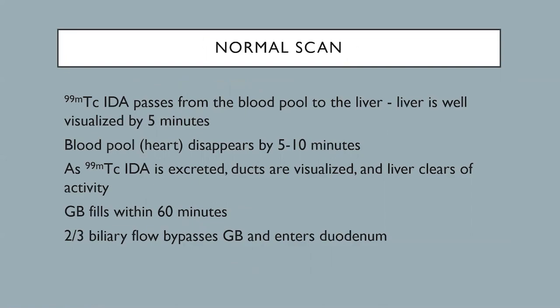In a normal scan, the radiotracer passes from the blood pool to the liver, so the liver is well visualized by 5 minutes. Activity should be cleared from the heart by 5 to 10 minutes. Activity is then excreted into the bile ducts, which should be well visualized, and the liver clears of activity. Approximately two-thirds goes to the duodenum and about one-third is stored in the gallbladder.